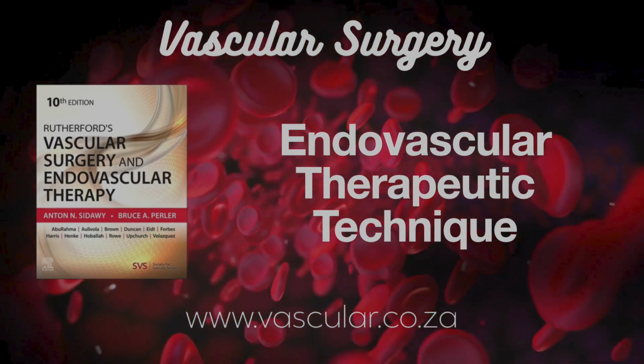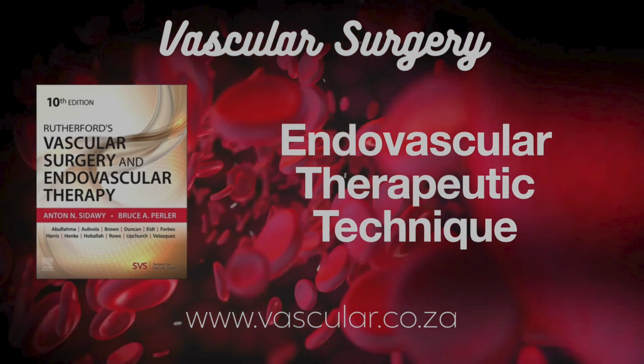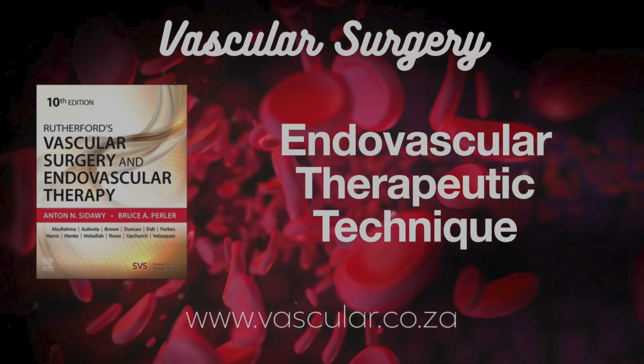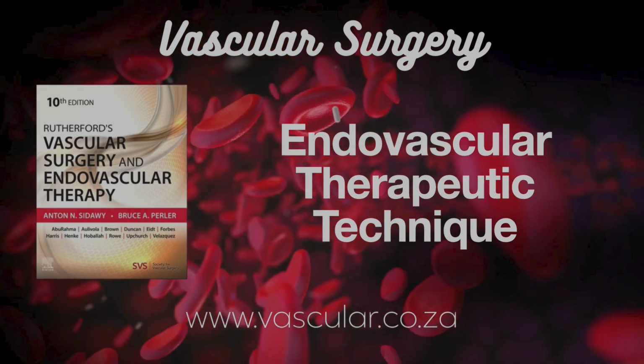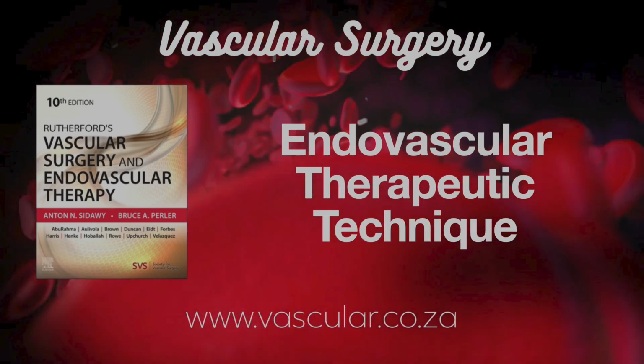It's a balance. The source describes different VCD types. First, extravascular plugs sealing from the outside. Right. These deploy some material outside the artery at the puncture site. AngioSeal is a common one. It uses a tiny anchor inside the artery, connected by sutures to a collagen sponge outside. It sandwiches the hole and dissolves in 60-90 days. Yeah, used for 5 to 8 French sheaths.